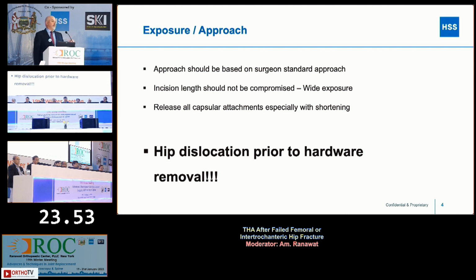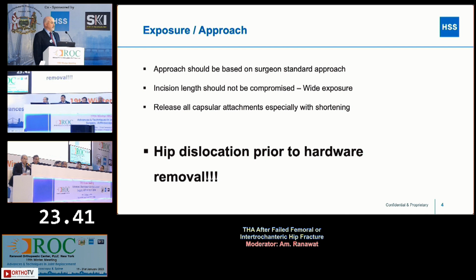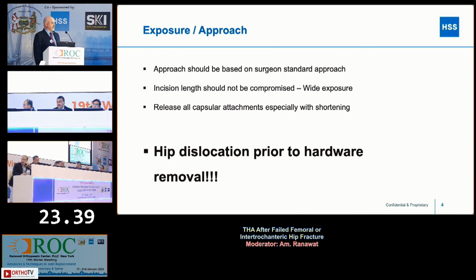So tell me, from the posterior approach, some techniques to get capsular releases. I'll take a standard approach as much as possible and go flush with the posterior trochanter and keep the soft tissue intact. Most of the time, if the trochanter is already fractured, then you can reflect it and go into the hip joint. I'll try to dislocate the hip with the implant and then try to take out the implants.